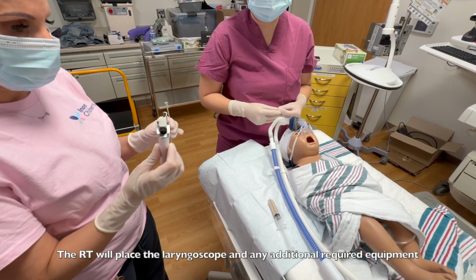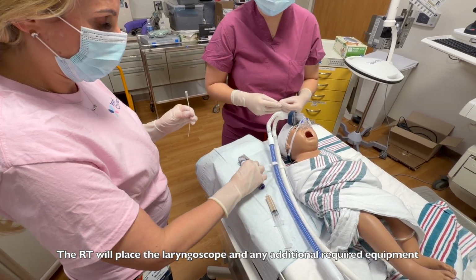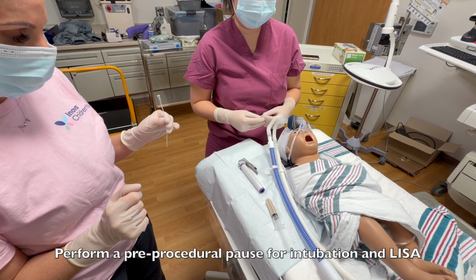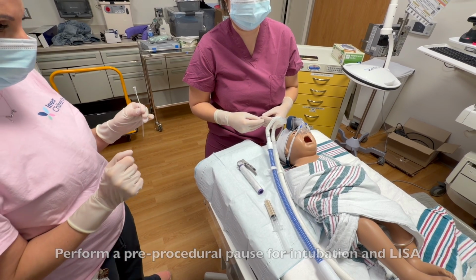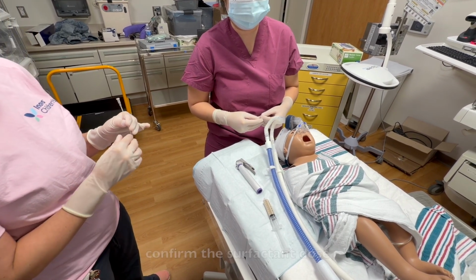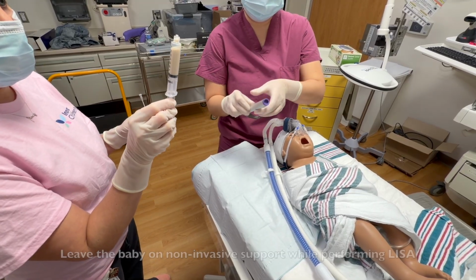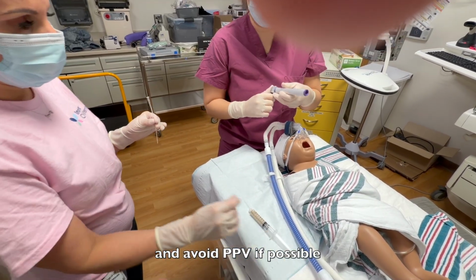The RT will place the laryngoscope and any additional required equipment on the clean field to the right of the provider. Perform a pre-procedural pause for intubation and LISA, confirm the surfactant dose, leave the baby on non-invasive support while performing LISA, and avoid PPV if possible.